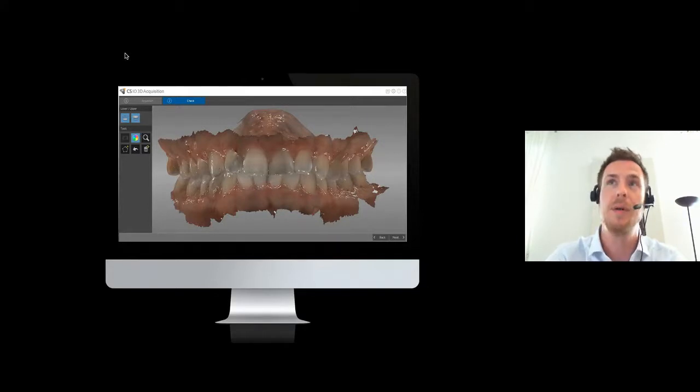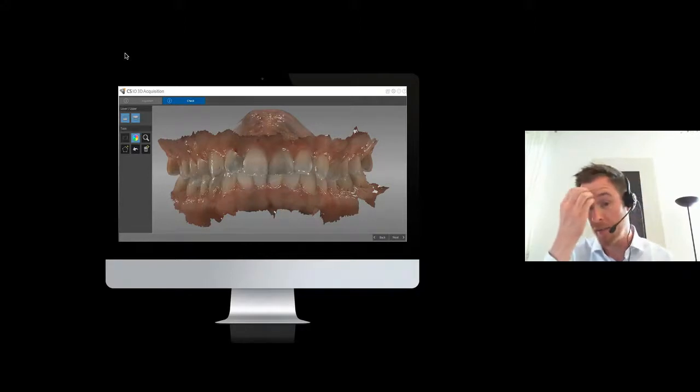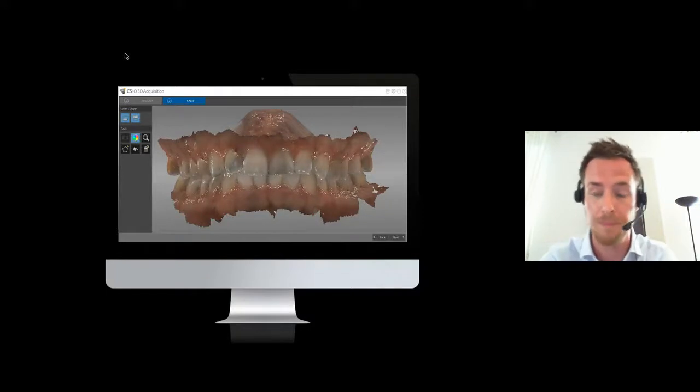You have to pay attention to the costs or the yearly fee, and what is more important is how to continue with your designing process, how I can use the intraoral scans in a third-party CAD software or in another software. This is the most important question of all.